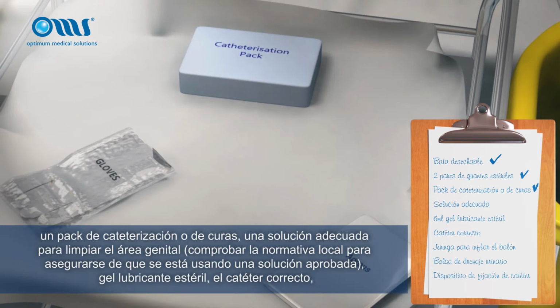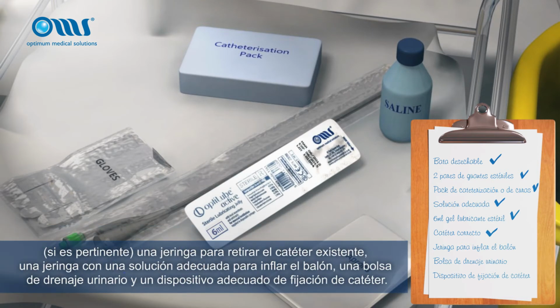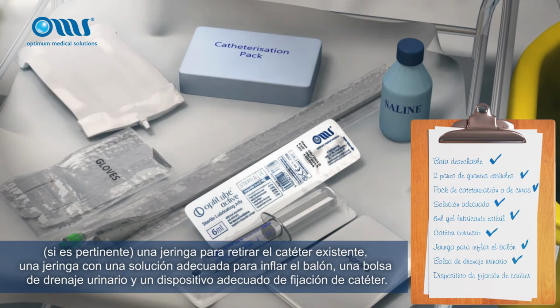A catheterization or dressing pack. A suitable solution to clean the genital area. Check your local policy to make sure you are using an approved solution. Sterile lubricating gel. The correct catheter. If applicable, a syringe to remove the existing catheter. A syringe with a suitable solution to inflate the balloon, a urinary drainage bag, and a suitable catheter fixation device.